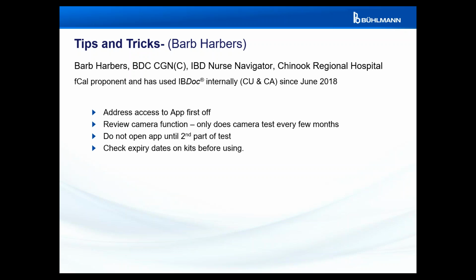But that's not the only issue, because sometimes patients just don't quite get how to access the app or how to download it properly, or truly how to navigate the app once they get on it. And so what I do now, when I first introduce a patient to this program, is we sit with their phone, we open it up, we download the app right in front of me so I can see how it's working, and we kind of just navigate the portal a little bit, even though they can't log in yet, but we go through the things that they're going to need to get started right away. That way I know that at least they've seen it and they know what they're looking for, and we know they can access the app and it's already in their phone.